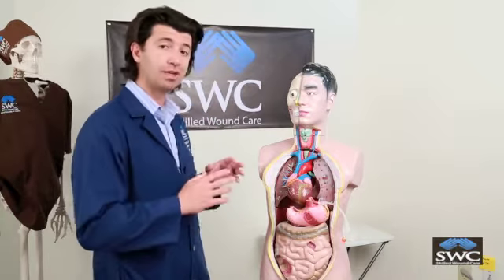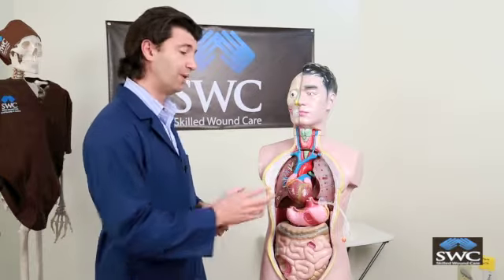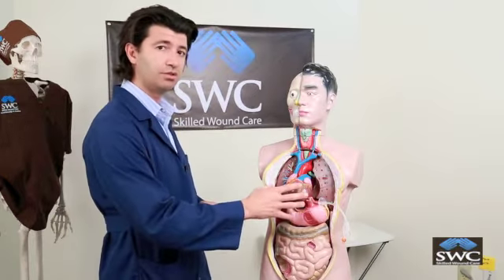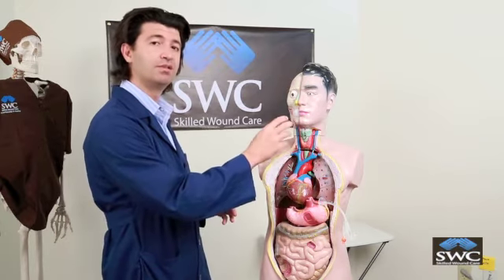Today I will be going over gastrostomy tube issues in the skilled nursing facility. We generally place gastrostomy tubes in patients right into the stomach. The reason we do this is to feed patients directly into their stomach, to bypass their esophagus and their swallowing if they're unable to swallow. We also do this if patients sometimes need an extra little hand getting some extra nutrition into the body.